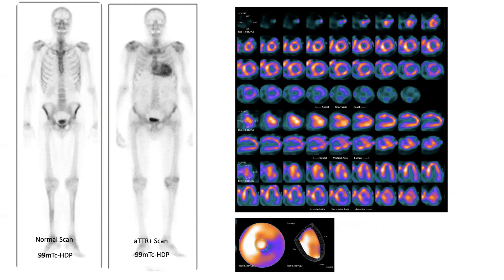This is an acquisition obtained by a CZT camera in a 3D manner. As you can see, this is a case of a patient with Perugini grade 3. We observe a homogeneous uptake of the tracer in the ventricular wall. In this case, there is also positivity of the right ventricle, making it a very complex case, but as you can see, SPECT acquisition is quite straightforward to manage.